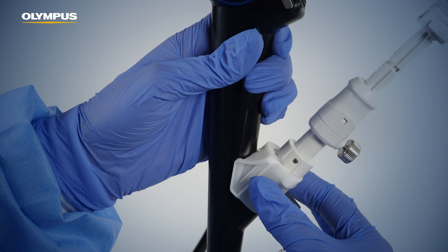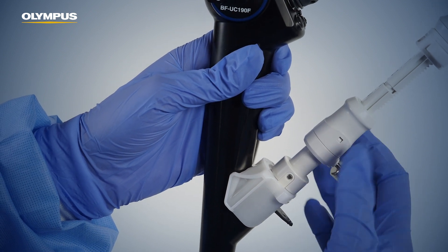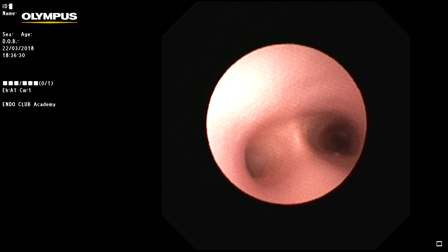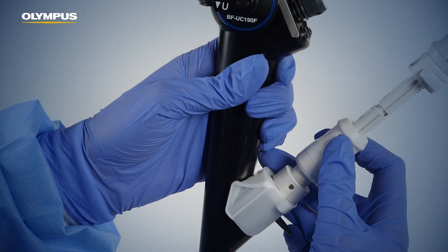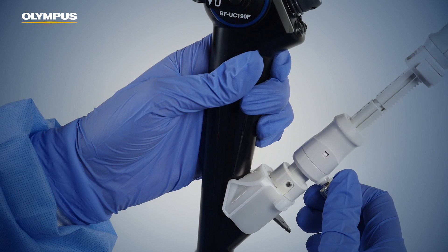Care has to be taken that the needle sheath is inserted far enough distally so that it extends beyond the end of the instrument channel. The adjustment is done by loosening the sheath adjuster knob and slowly advancing the sheath while the sheath position is monitored in the endoscopic image. Only the distal part of the needle sheath should be seen in the endoscopic image. Once the correct sheath length is found, rotate the connector section so that the handle is easy to hold, and securely tighten the sheath adjuster knob by turning it clockwise.